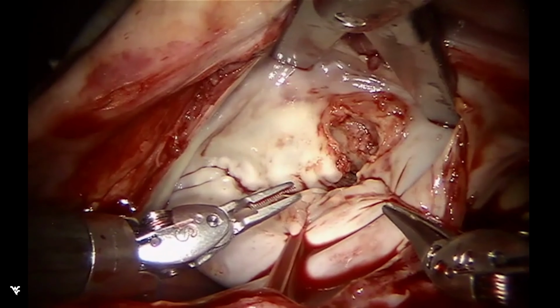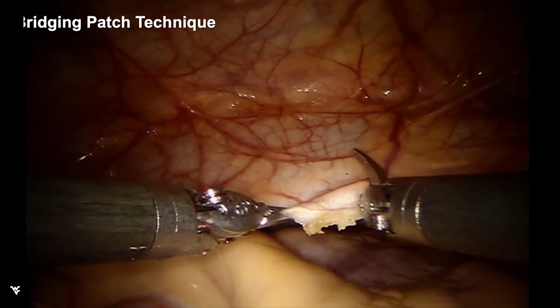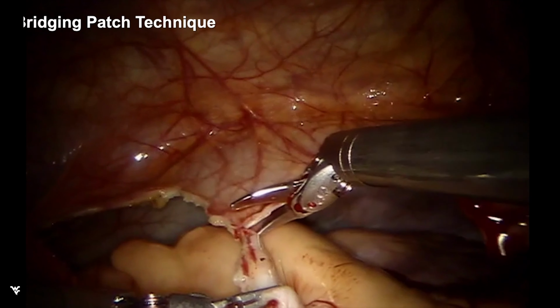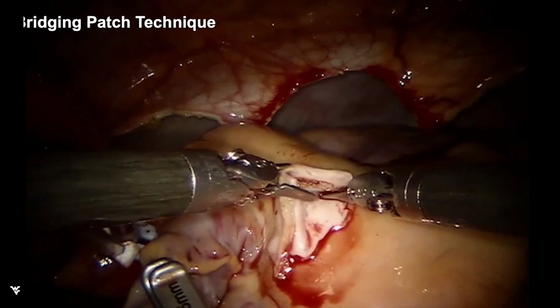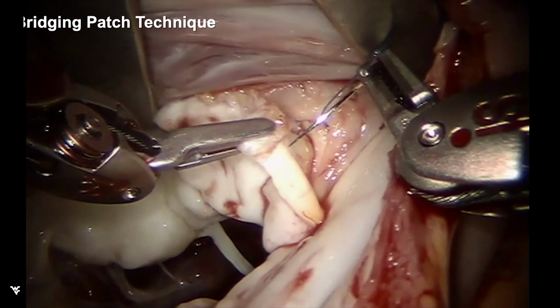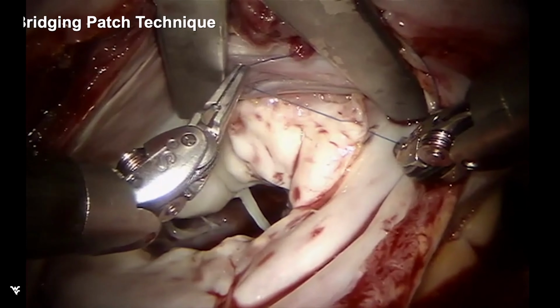And so the first step in any treatment of endocarditis is full and complete debridement of all infected material. We utilize this technique that we've called the bridging patch technique by harvesting autologous untreated pericardium to bridge the gap, particularly in lesions that impact the commissures.